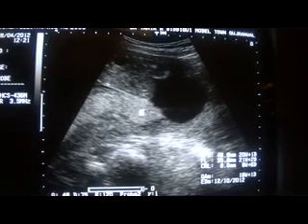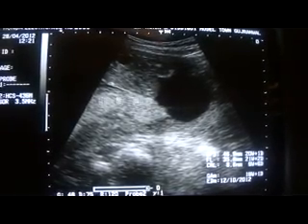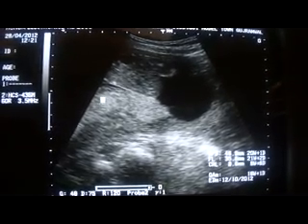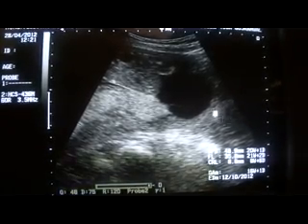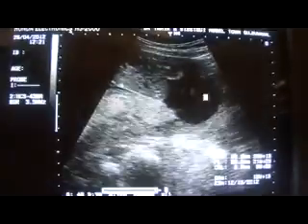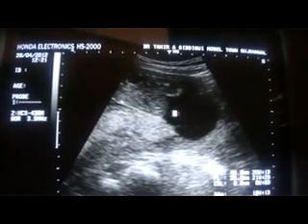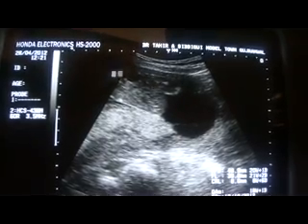This is the placenta. So this is the low lying placenta. This is the internal os and the length of the cervix is 4.9 centimeters.